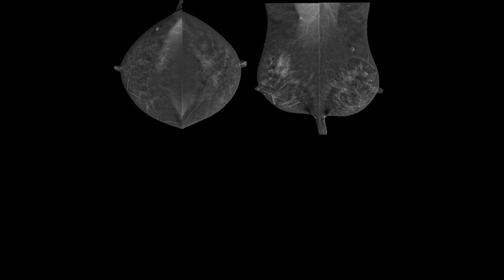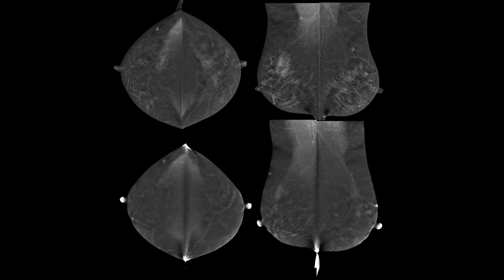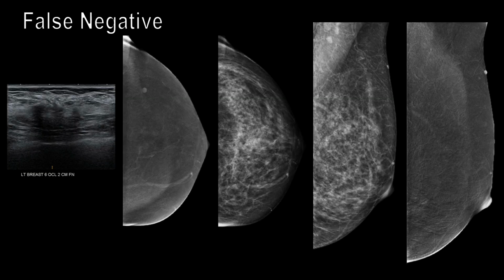We can tailor the study to the patient's menstrual cycle. It's not very realistic in a diagnostic setting. We don't want to put the patient's treatment on hold, but it can be done in a screening setting or in the follow-up setting for patients that we want to come back, like BI-RADS 3. In this case, you can see the differences in the same patient when the exam was tailored to her second week of the menstrual cycle.